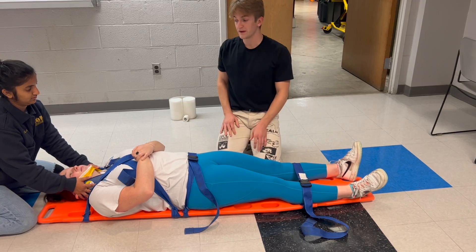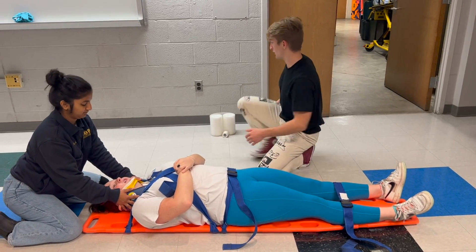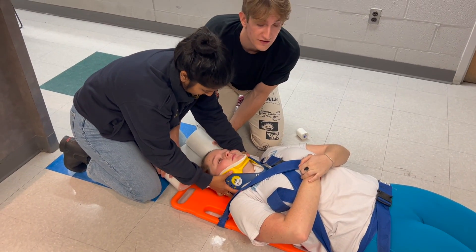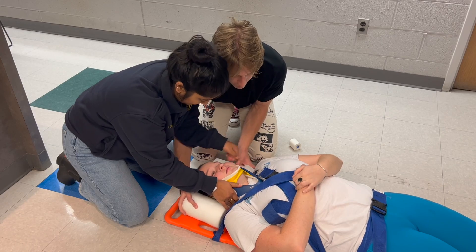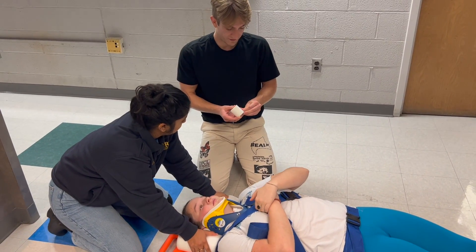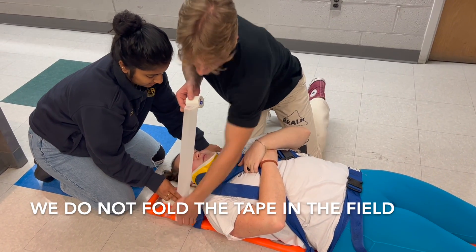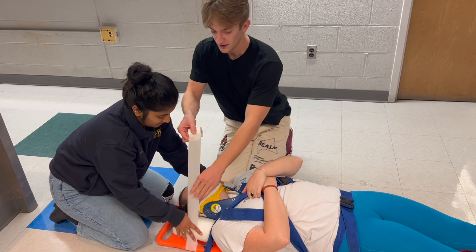Our final step in securing the patient is adding the head rolls so that the neck is completely secure to the board. We coordinate with the partner at the head to slide the head rolls under — she will lift the patient's head just the slightest bit to fit the head rolls underneath, and then move from holding the C-collar to positioning the rolls. I will now secure the patient's head to the board with tape. In the field we do not fold the tape. The tape reaches from the side of the board underneath the board — you may need to wrap it around a couple of times, and if the environment is wet, make sure the tape is as secure as it can be.